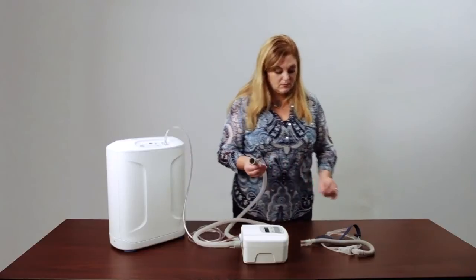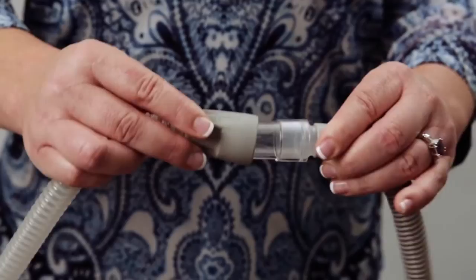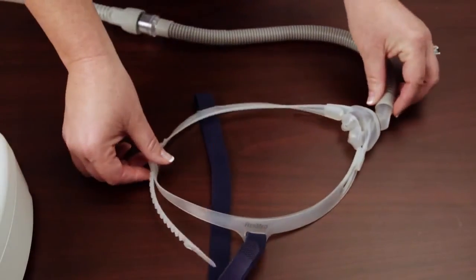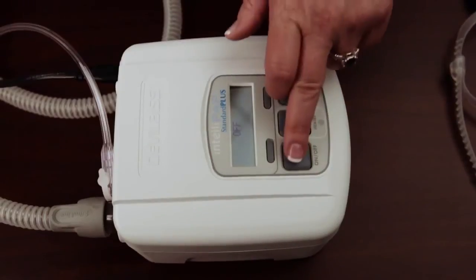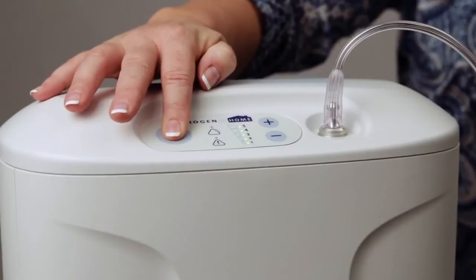Connect the other end of the CPAP tubing to the mask. The oxygen will flow in through the adapter along with the air pressure from the CPAP machine. Turn on the CPAP unit first and then turn on the oxygen concentrator.